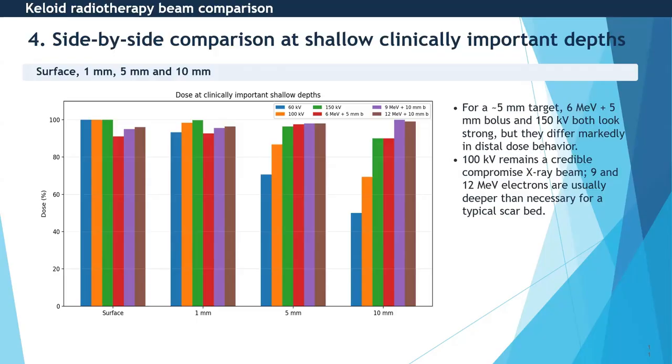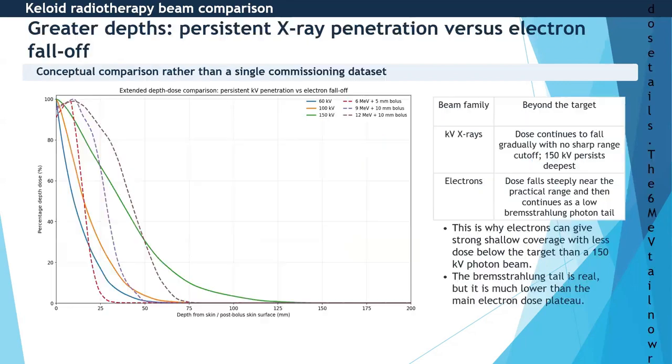I just quickly looked at the iridium wire, which someone mentioned before. If we have 100% at half a centimeter deep, and we take that as a reference point, then at another half centimeter deep, the dose will have dropped from 100% to just over 40% at the 1 centimeter depth. And if one goes out to about 5 centimeters deep, it will have fallen to a few percent, maybe 5% or so.